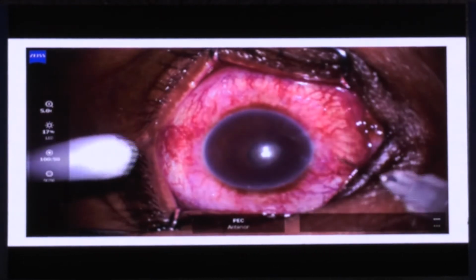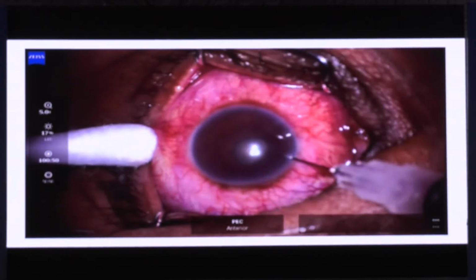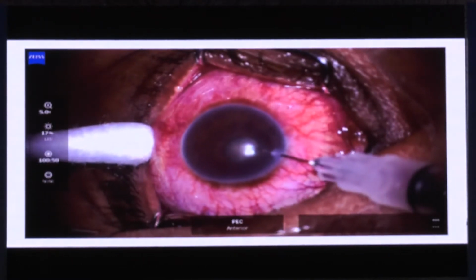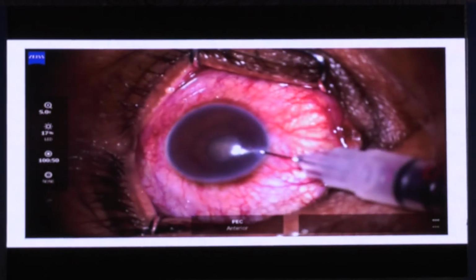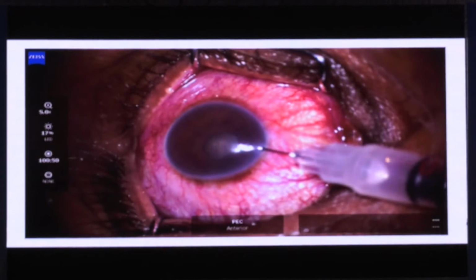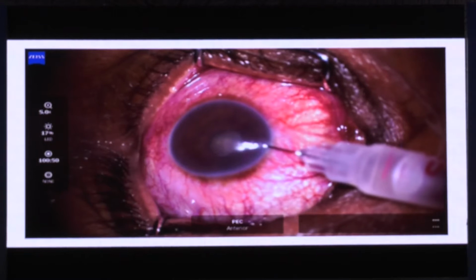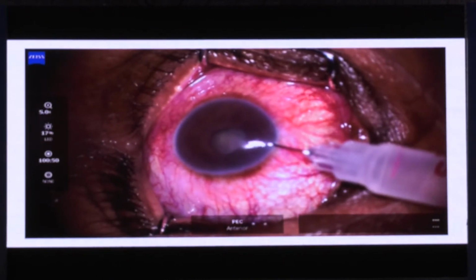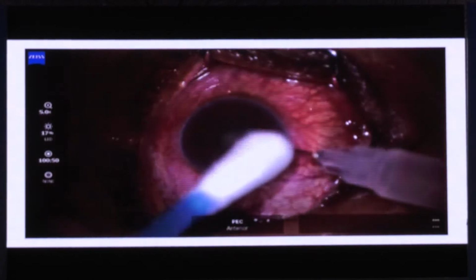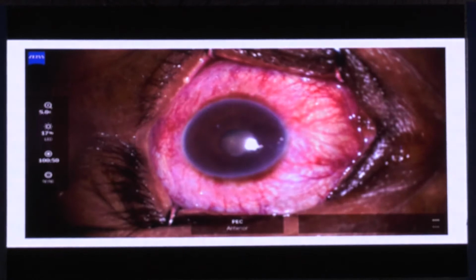So we anesthetize the eye, and with an insulin syringe, which has a 30 gauge needle already attached, you enter the eye, and you can stabilize it with a pledget from the other side with the bevel up, and then you remove the aqueous. This can be done either by pulling the plunger, or in a passive way, where you just remove the plunger and use a pledget to push in the aqueous through this. And then you put in some antibiotics, and then you patch the eye.